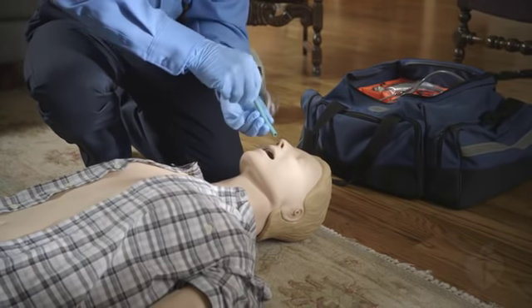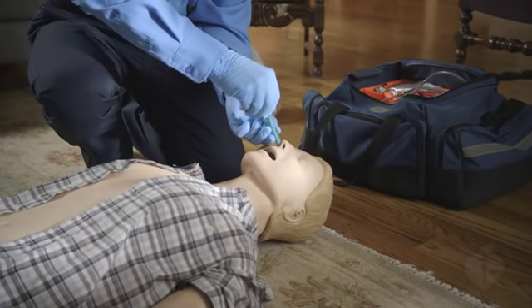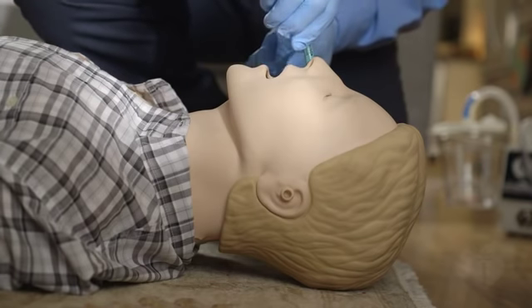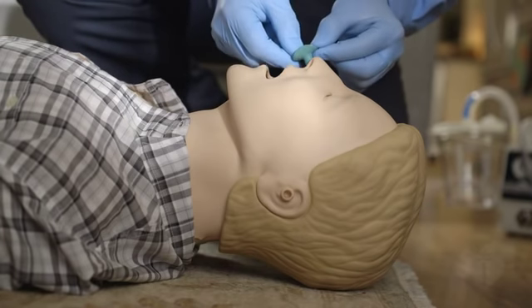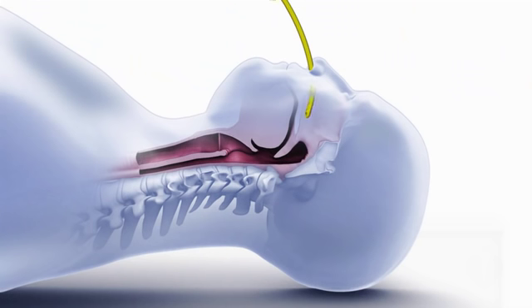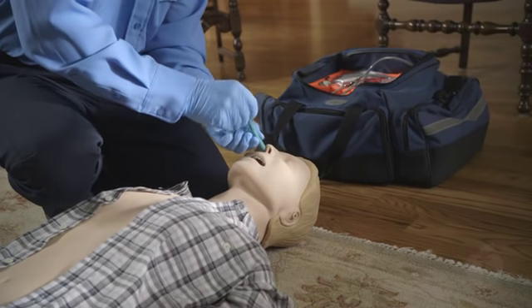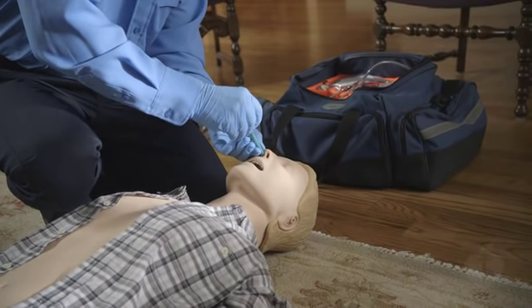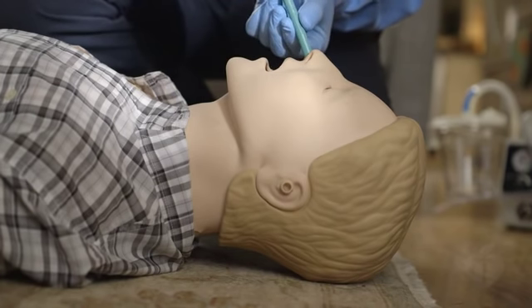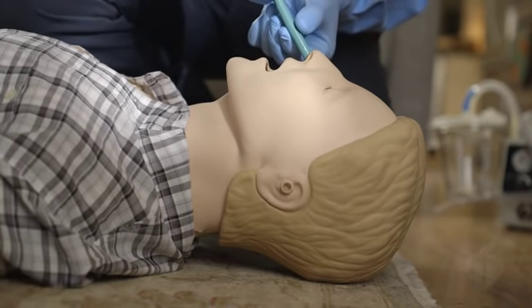Insert the NPA through the nostril in a posterior direction perpendicular to the plane of the face. Using moderate pressure and a gentle spiral motion, push the device into the nostril. When inserted correctly, the NPA should reach beyond the nasal cavity to the pharynx, providing a clear path for ventilation and suctioning. If you encounter resistance during insertion, gently withdraw the NPA a centimeter or so, slightly rotate it, and gently try to insert it again.